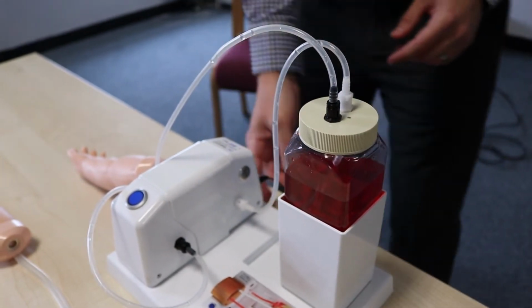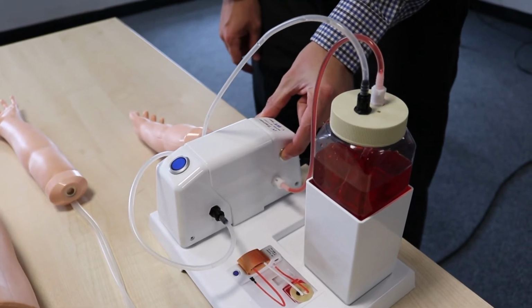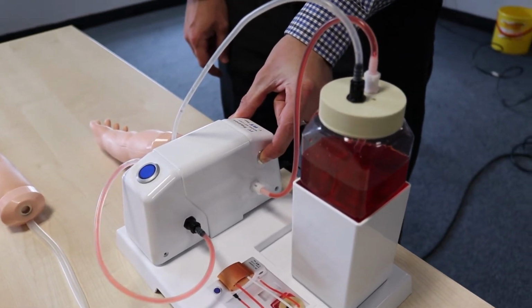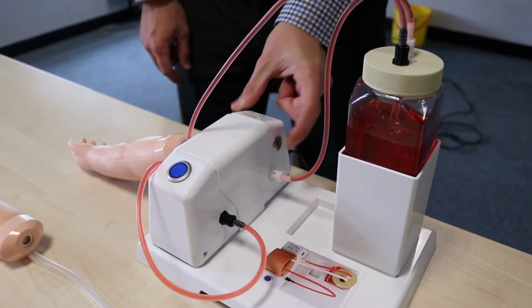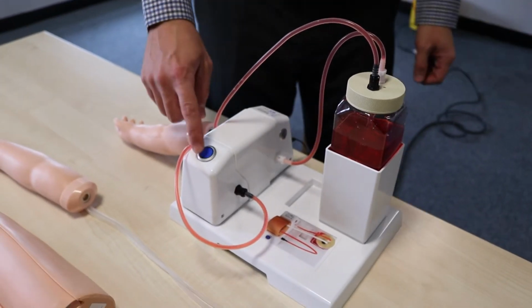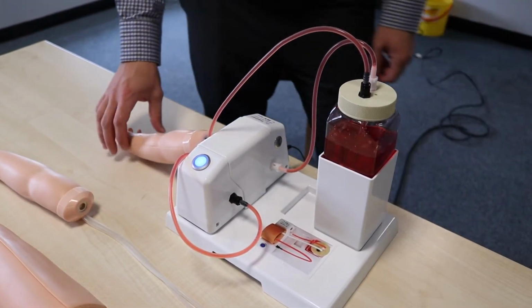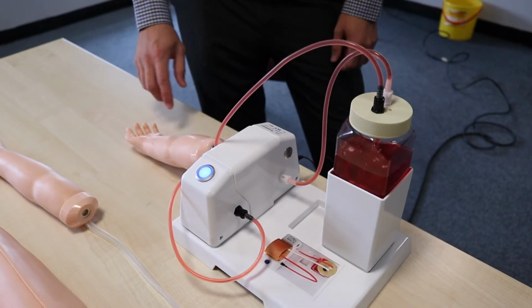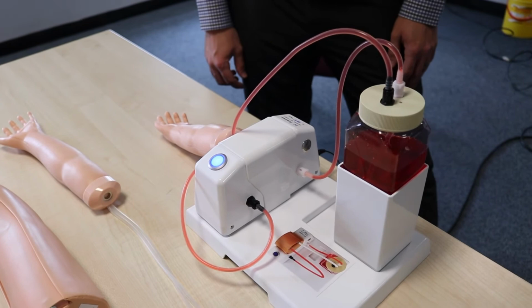That one there. We're plugged in, but we can also run on battery power. And I'm going to run the pump. Once the blood's all the way through, you're ready to go. And then you push the blue button, and that gives us a continuous pump so that when you do your cannulation or venipuncture, you get a flashback.